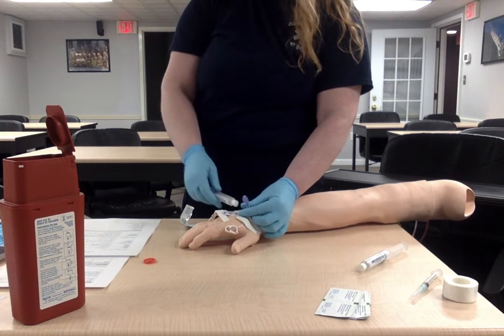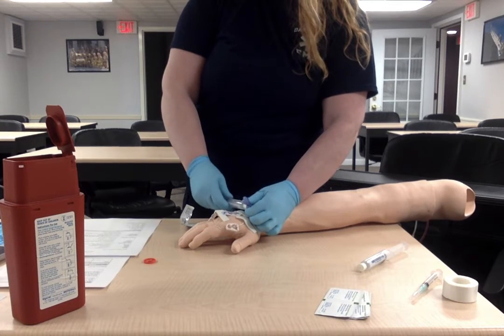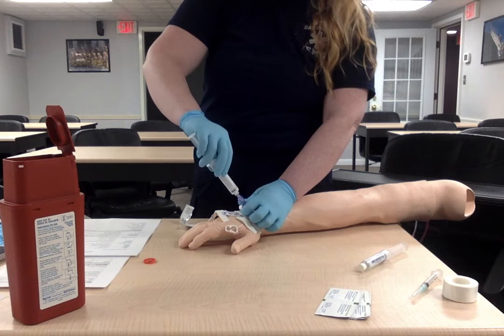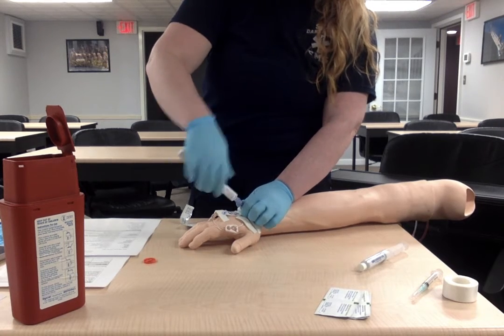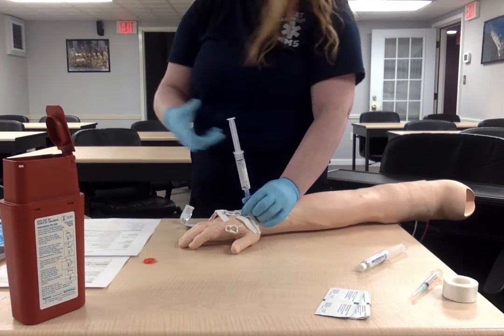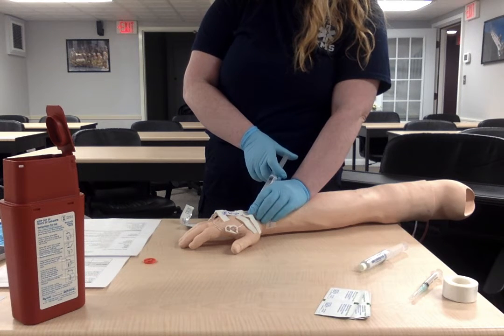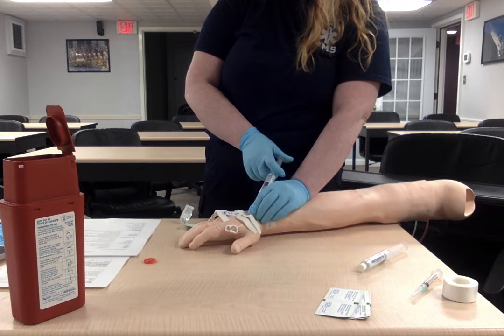Again, it's covered, so we don't have to worry about that. We're going to remove it, make sure nothing touches this as well as the port. Once this is dry, we can connect this. Once that's connected, we can push 1 to 3 mLs to make sure all the medication is flushed through the lock set and that all the medications have been administered to the patient.